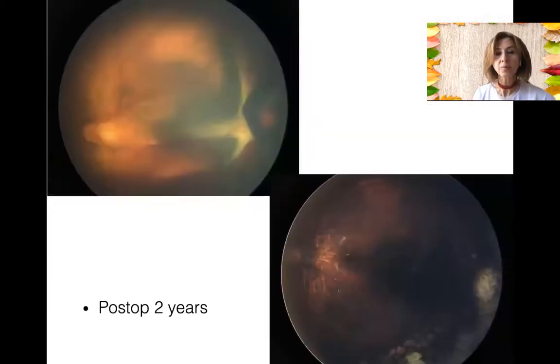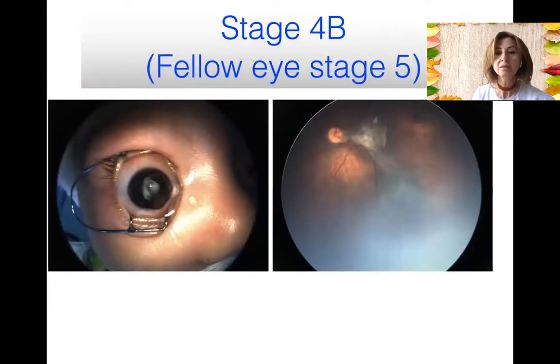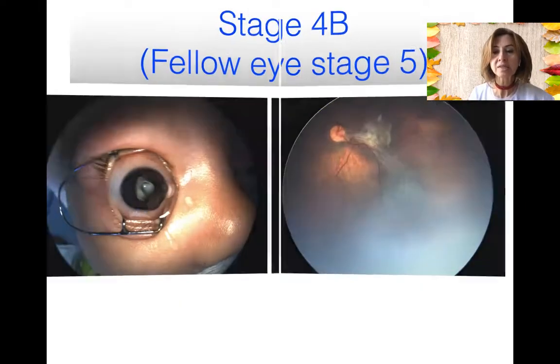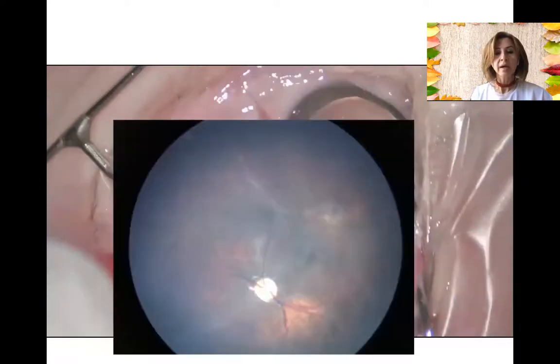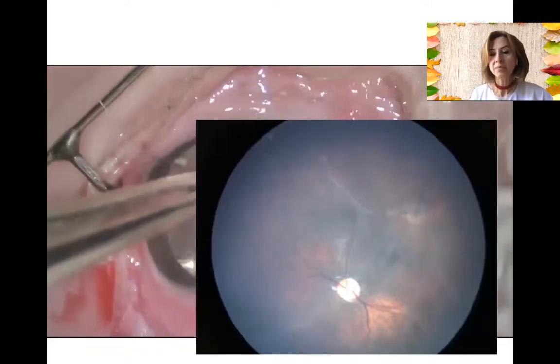Another stage 4B case, as you see, this is the post-op 2 years appearance, so the fovea could be attached nicely. In another 4B case, the fellow eye was already stage 5, and we had to open those membranes in the macular area without causing any retinal break. We always leave the eye in air at the end. We relieve the tractions and leave it alone. It usually attaches by itself within weeks, as you see here. And this is the post-op appearance of the same case.